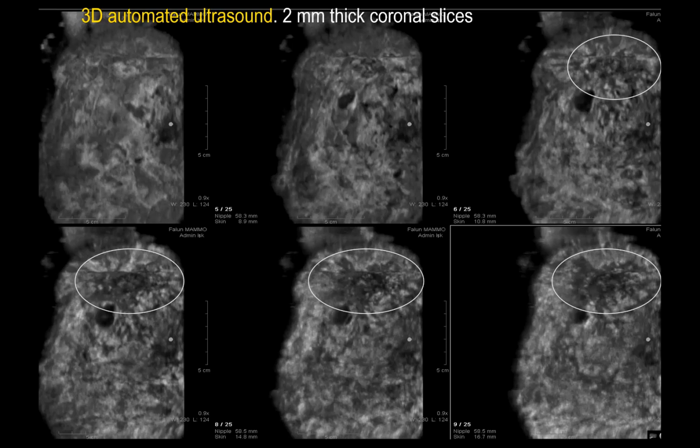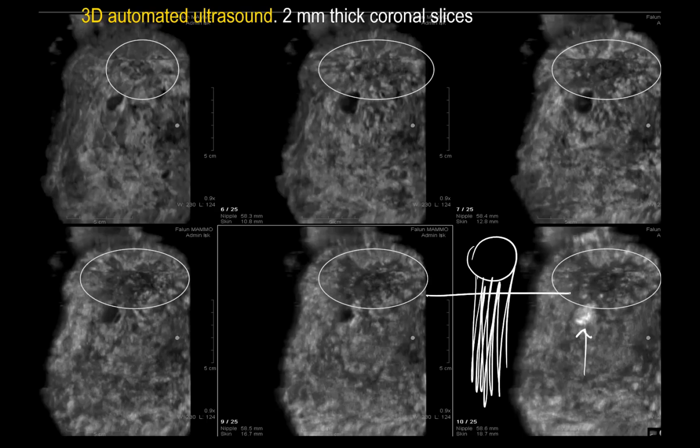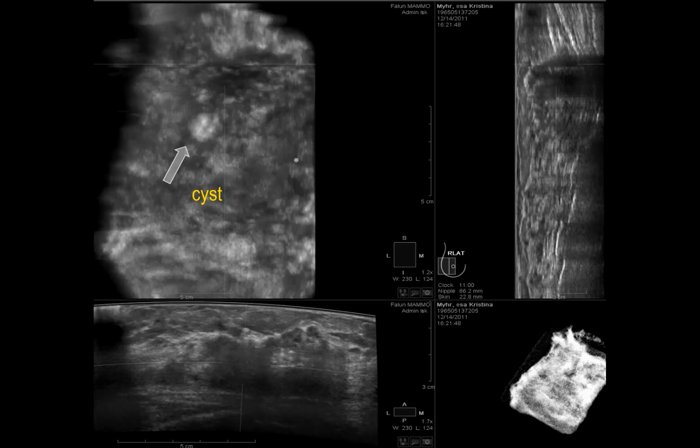And one of them slowly but steadily becomes white. Why? Because it's a cyst. So you are slicing now the through transmission. That is a cyst. That is not important. But what about this one? Now that's going to be a cancer, and a huge one. Huge carcinoma. Look at this. And the mammogram was negative. That's not fair. It's not fair.